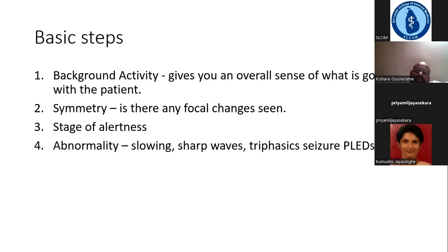Also, often on the EEG the technician will annotate whether this patient is awake or asleep or drowsy. And that's very important, because sometimes when we are interpreting the EEG, we can interpret it erroneously, where we might think that these patients have some epileptiform discharges, whereas actually the components that look like epileptiform discharges are actually changes that occur during sleep.